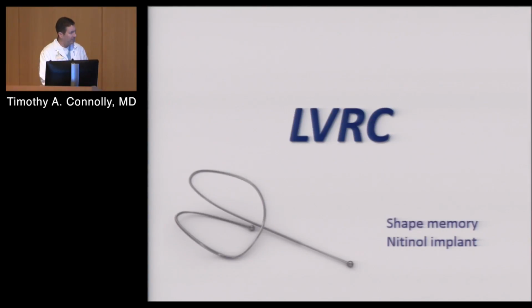Now, I do a lot with COPD, and I put this here. I'm going to show you some other pictures and images. Lung volume reduction coils. This is a research project that I've been involved in at St. Luke's and here at Methodist. It uses an alloy of nickel and titanium that's a memory-shaped metal. So when you pull this thing straight and let it go, it folds back into this shape.